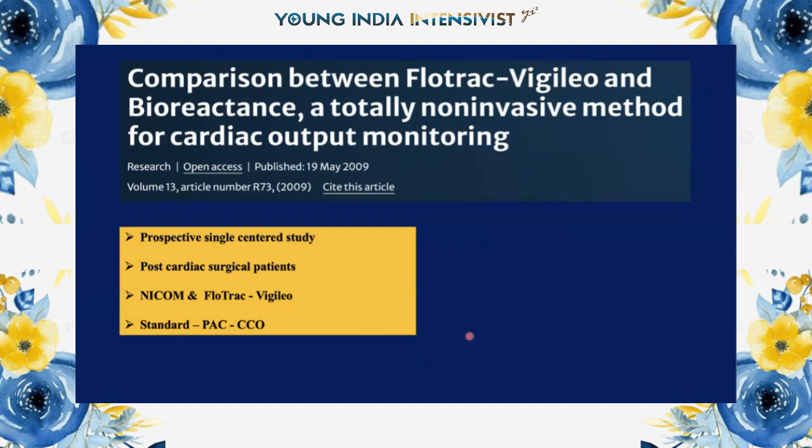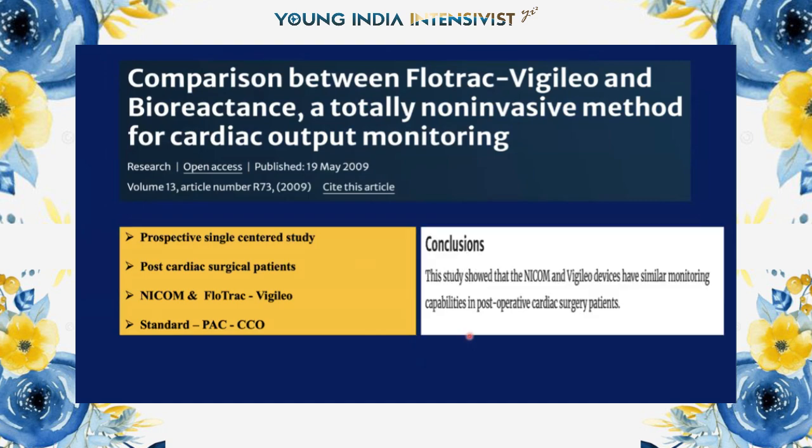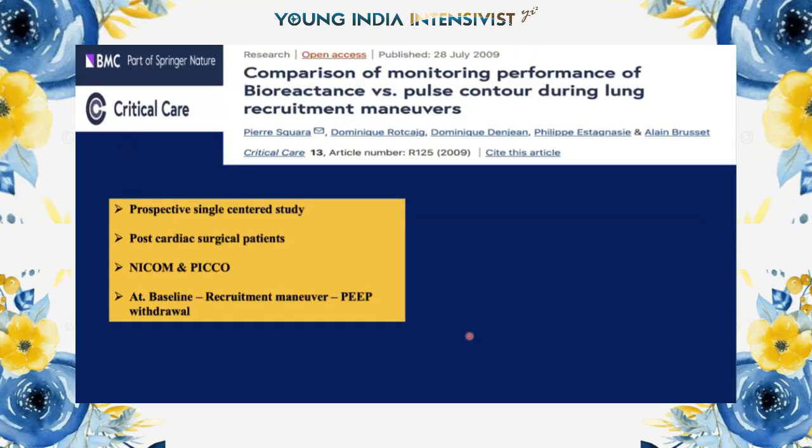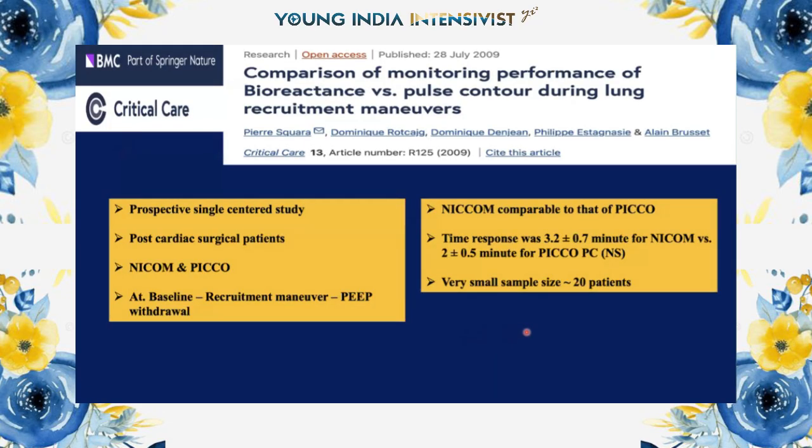And here also NICOM, which is bioreactance based, showed similar monitoring capabilities in post-op cardiac surgical patients. When they compared NICOM and PICO, it is comparable to PICO monitors.